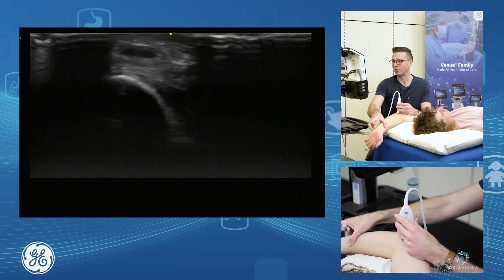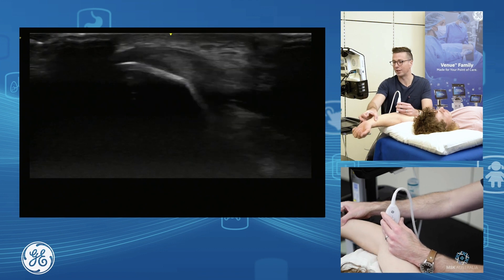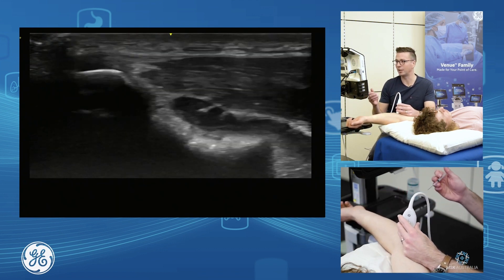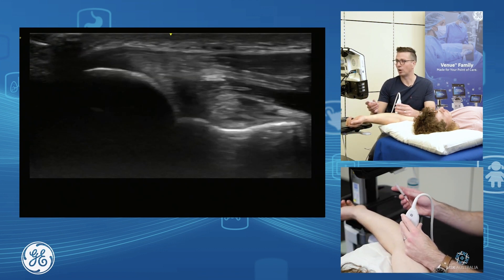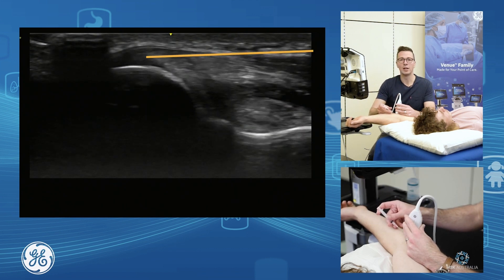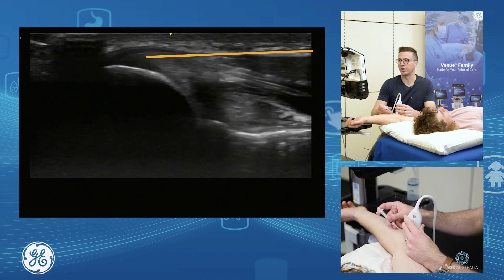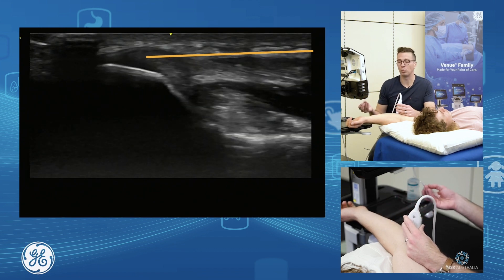I might put the elbow into a bit more extension to get the nerve out of the way — he needs quite a lot of extension — so I might even position his arm out here to move the ulnar nerve clear, and then do my injection. I can dry needle, inject intra-tendinous agents, or inject peritendinously, depending on your aim.